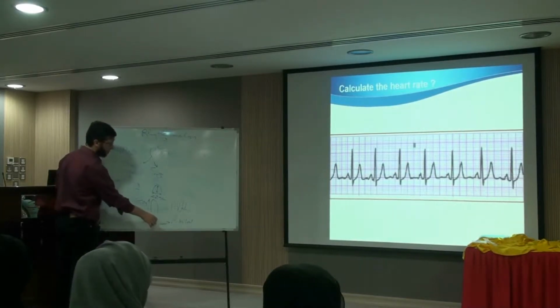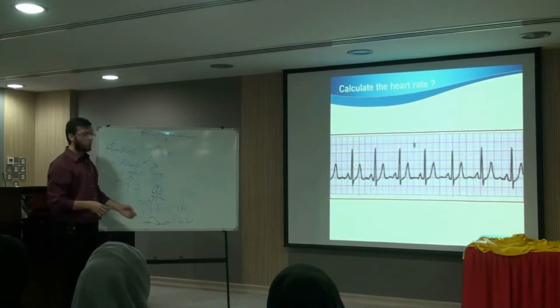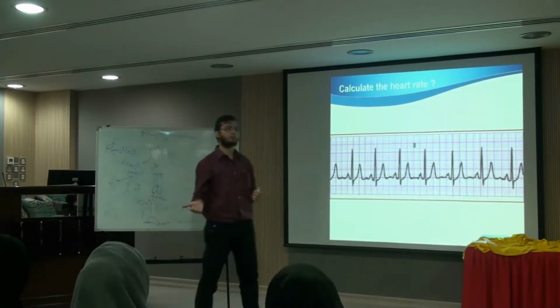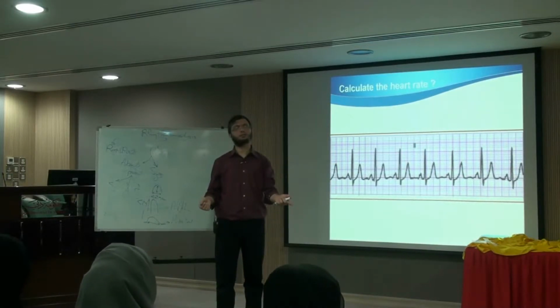The width became more. So why does this happen? What is the pressure in the right ventricle? And what is the pressure in the left ventricle? The left ventricle is higher, 120. Yeah. So imagine that there is an increase in the pressure in the left ventricle.